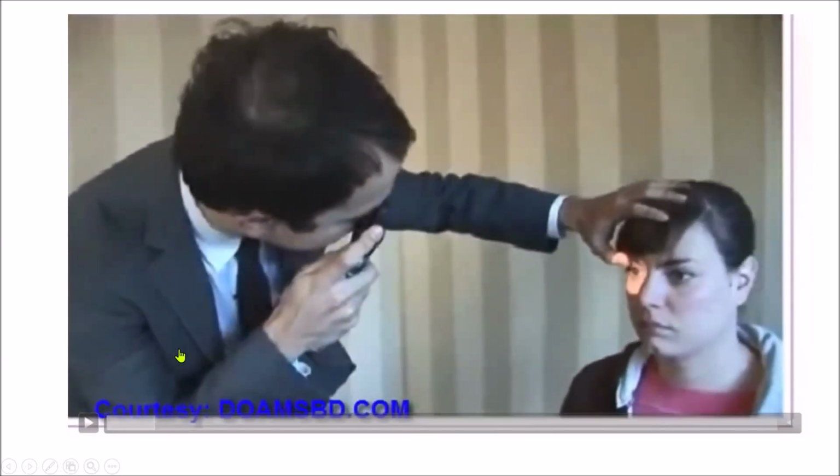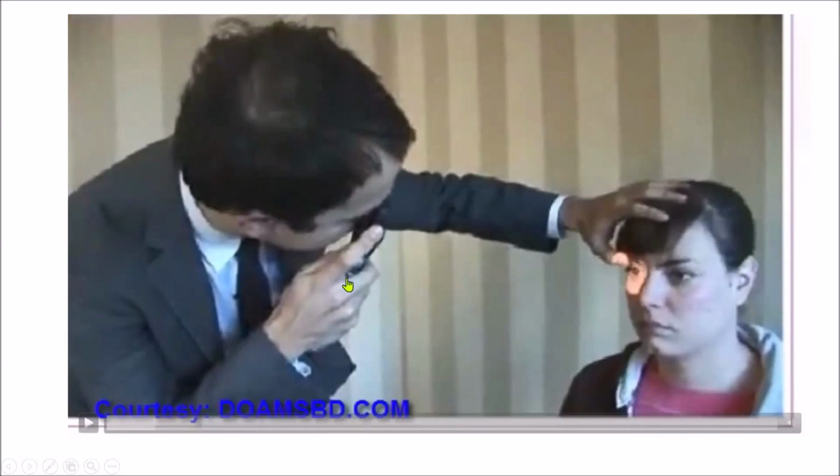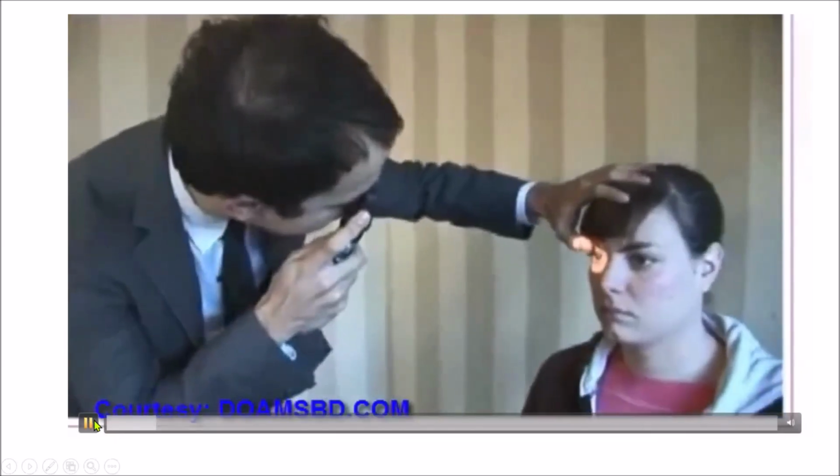From there, I'm just pausing here. Is the retina visible or not? Actually, the retina is not visible. Rather, you will find a rounded area with a background of redness. It is called the red reflex. I will show you in subsequent pictures what the red reflex is, and it is normal. You cannot see the retina from this distance. When you come closer, then you will see the retina. Please proceed now and follow.